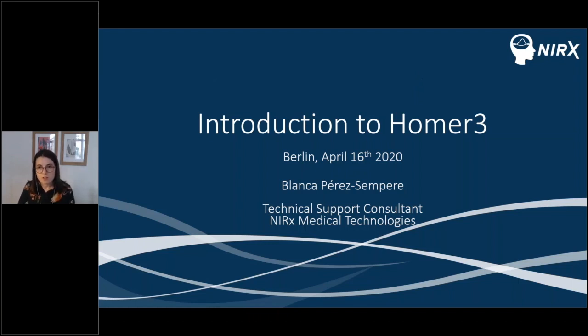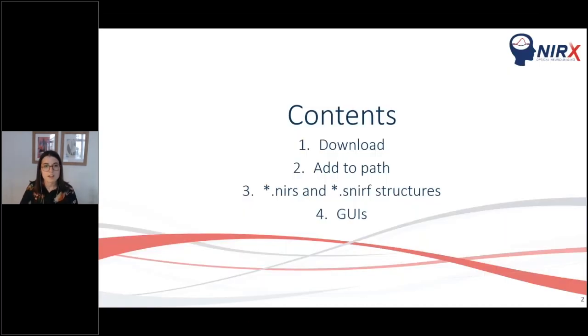We are going to introduce you to the Homer3 package. The same as my colleague Aisling, we are going to focus on the mechanics of the toolbox more than the analysis itself, because that's going to be covered by Dr. Marian Usual next Thursday.